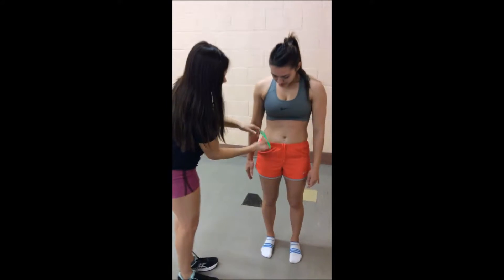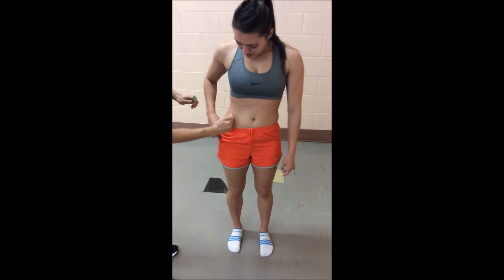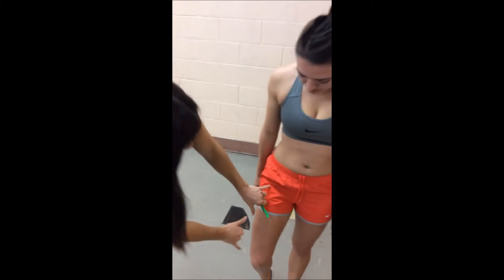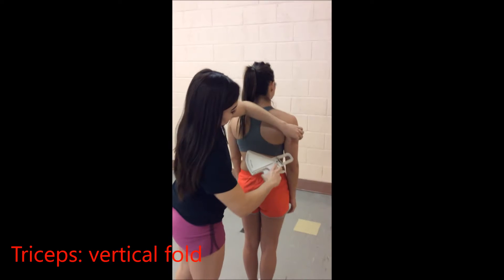The abdominal mark is 2 cm to the right of the umbilicus. The suprailiac mark will be in line with the natural angle of the iliac crest, taken in the anterior axillary line immediately superior to the iliac crest. The mark for the thigh will be on the anterior midline of the thigh, midway between the proximal border of the patella and the inguinal crease.